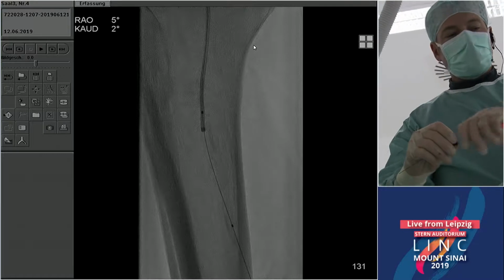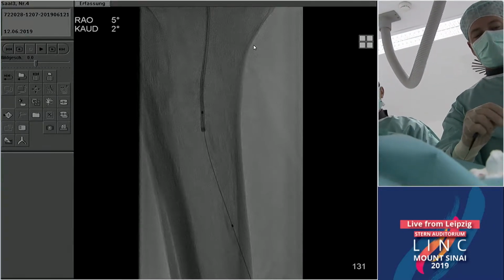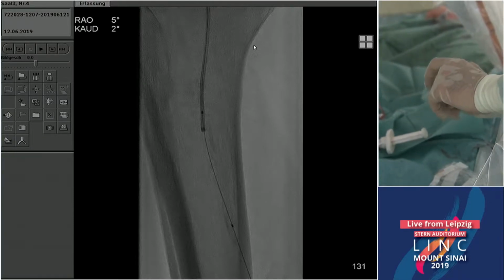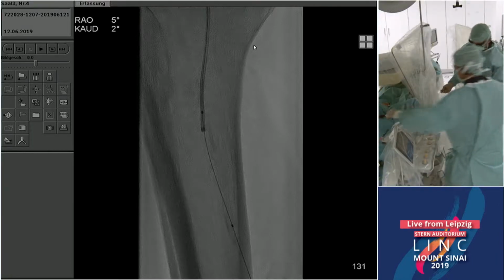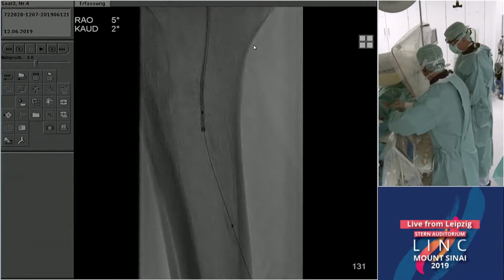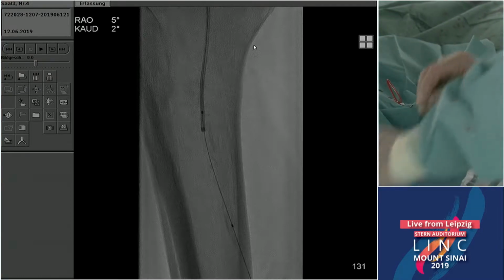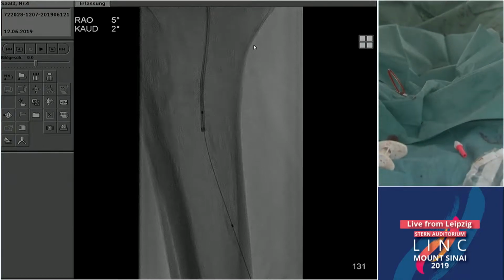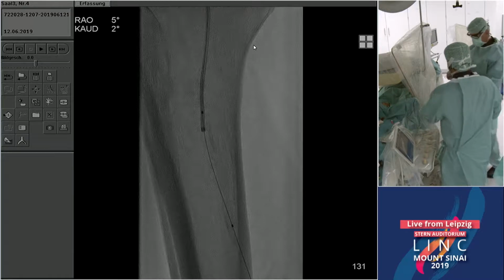Yeah, we thought here to take a scoring balloon down to completely pre-dilate. We have an AngioSculpt balloon, 2.5. I don't think it is too big. I remove the 2.5 catheter. Yes. Can you hold the wire? 100 millimeter long. They sometimes have a profile which is a little bit difficult to bring into tibial arteries, but of course with a pull-through wire, that should help us to bring it down.